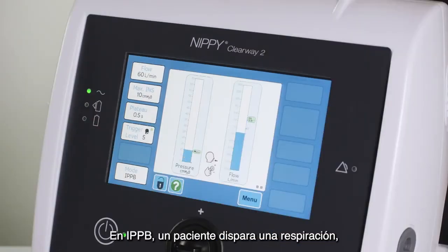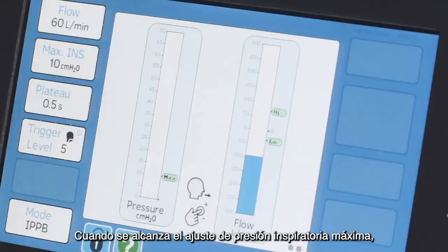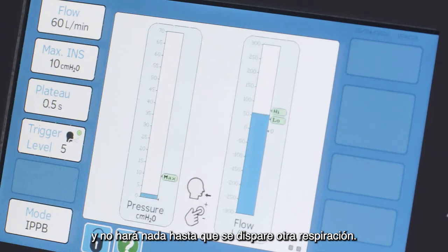In IPPB, a patient triggers a breath which is delivered by the Clearway 2 at the set flow. When the maximum inspiratory pressure setting is reached, the Clearway 2 cycles to zero pressure and will do nothing until another breath is triggered.